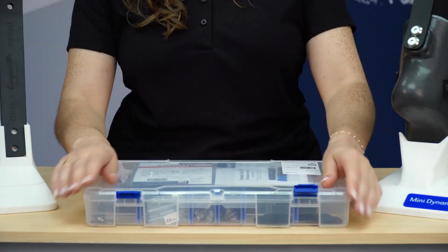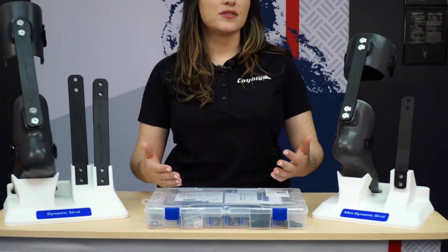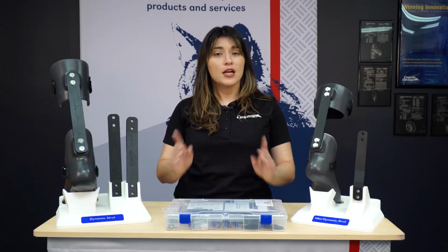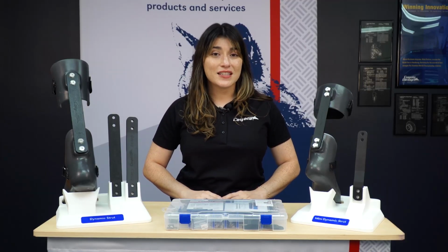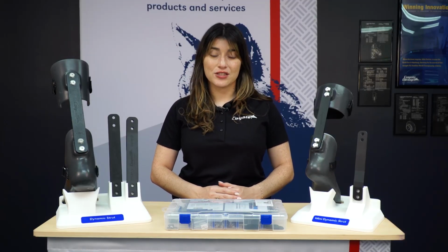These kits really help to reduce the number of items that you have on your shelf. So in terms of inventory, it helps reduce improper purchasing or being unsure of exactly what strut you should purchase to best optimize the functionality for your patient. Always ensure that once you have selected the proper strut for your patient, there is Loctite and the strut is torqued to the 5 to 8 Newton meters and retorqued during patient follow-up.